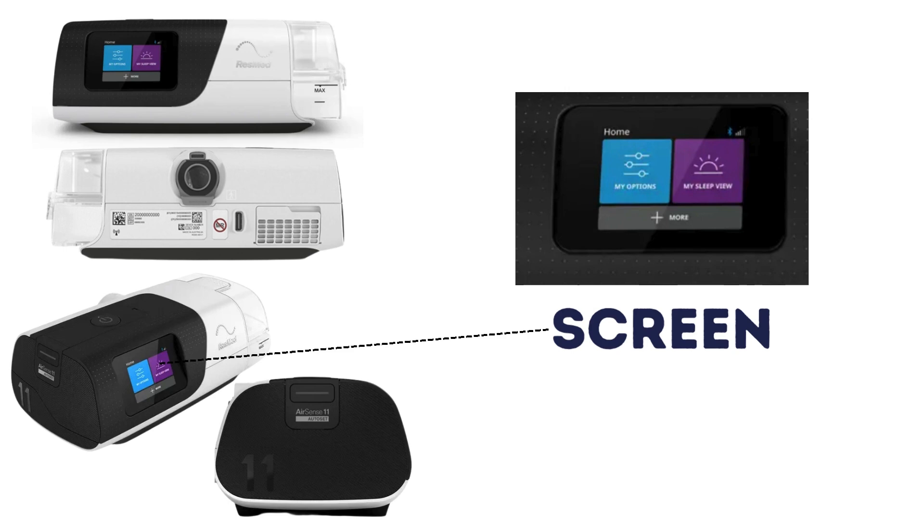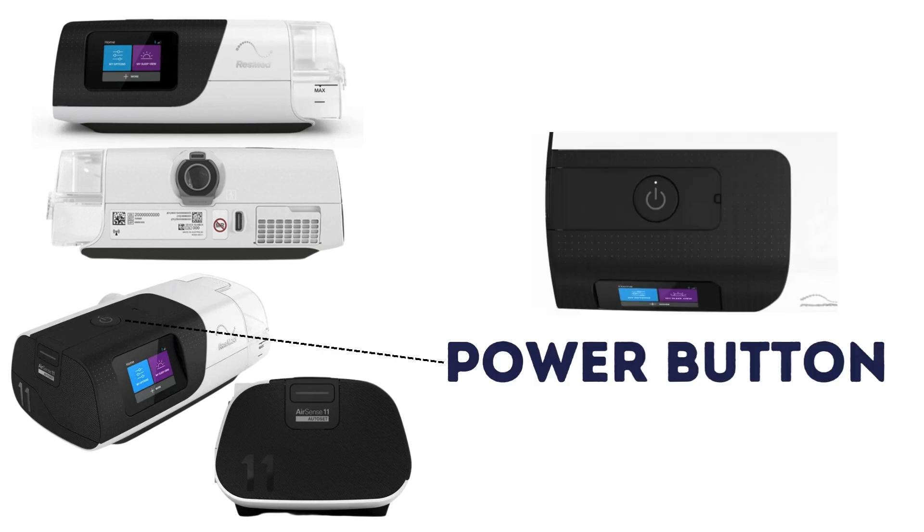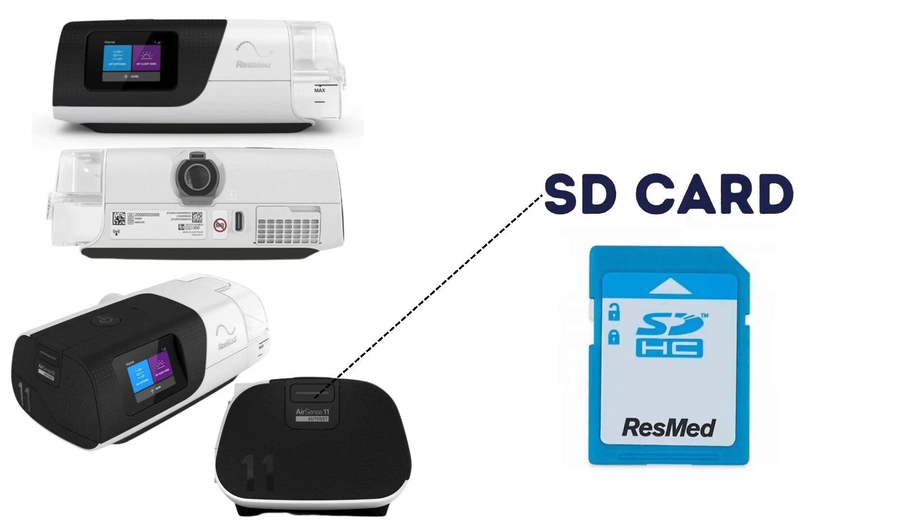Additional components include a screen to access reports and adjust therapy settings, a power button to start and stop CPAP therapy, and an SD card that stores a patient's sleep data.